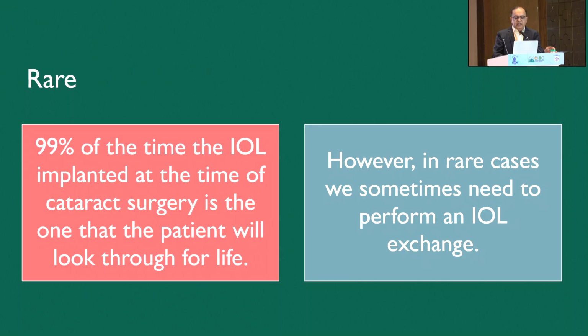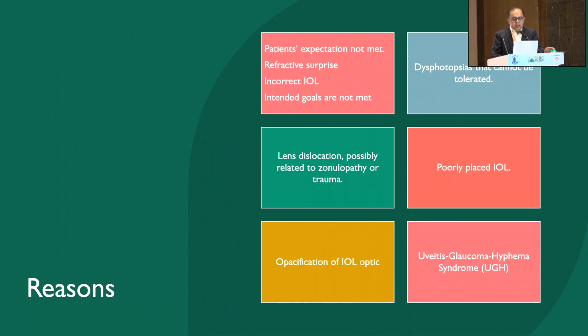However, in rare cases, we sometimes need to perform an IOL exchange. The simplest and the most common reason for the patient to seek an IOL exchange is they are not happy with their initial results. Especially in routine surgery, it's when certain expectations weren't met. That could mean the patient had refractive surprise or they didn't end up with their intended goals. Another reason is dysphotopsia in multifocal and trifocal IOLs.